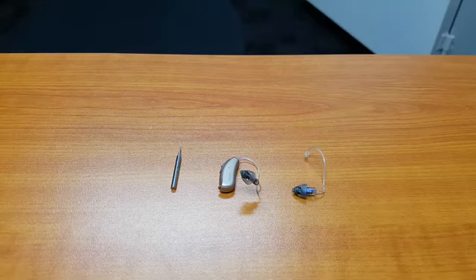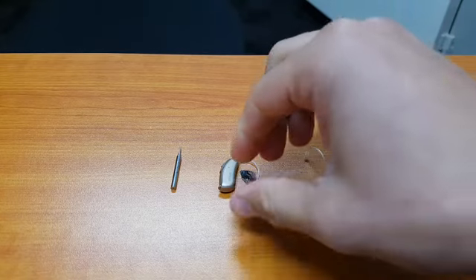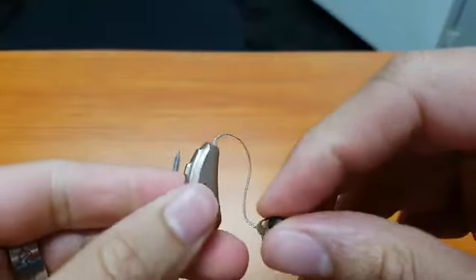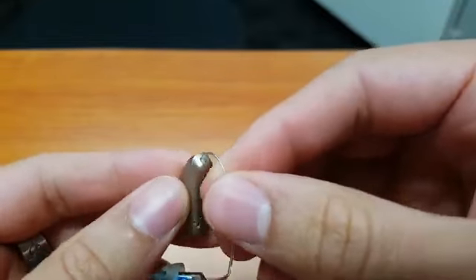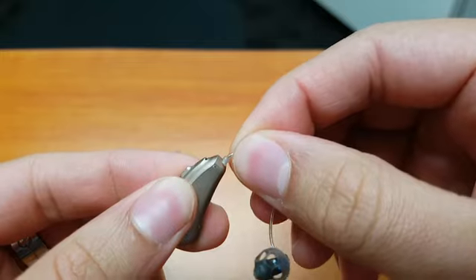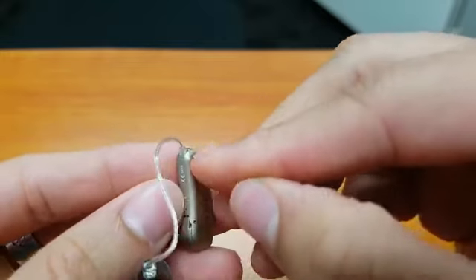So today I'll show you how to replace a receiver on a Phonak receiver in the ear hearing aid. So let's have a close look at the hearing aid first. So this is the hearing aid with the receiver attached. So if I give that a bit of a pull, it is pushed firmly and locked into place.